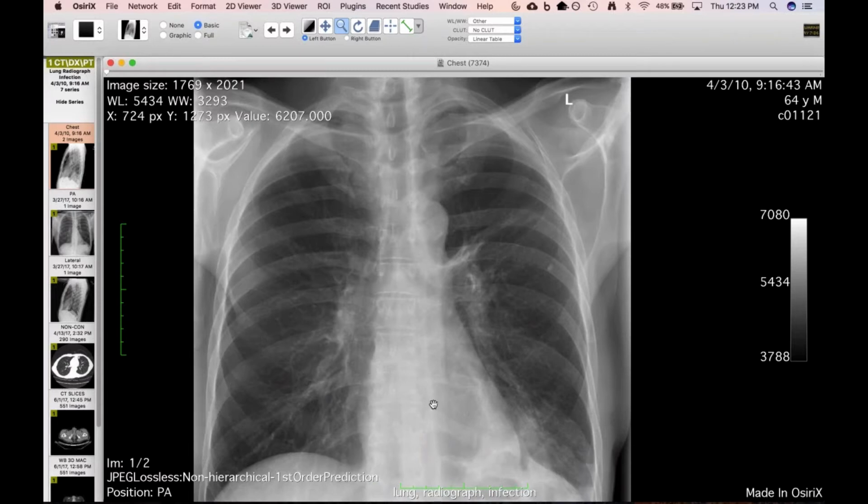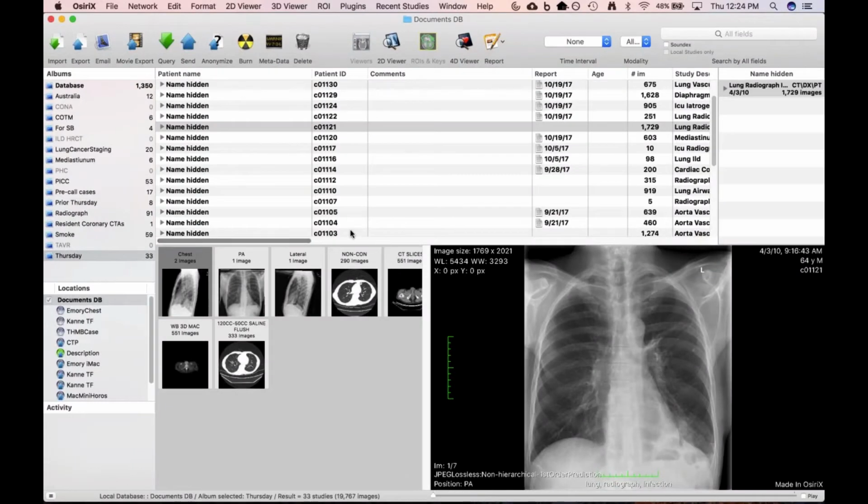Or maybe he was getting some hemorrhage down there. Sure. That's true too, yeah. He could have, I don't know the history back then.